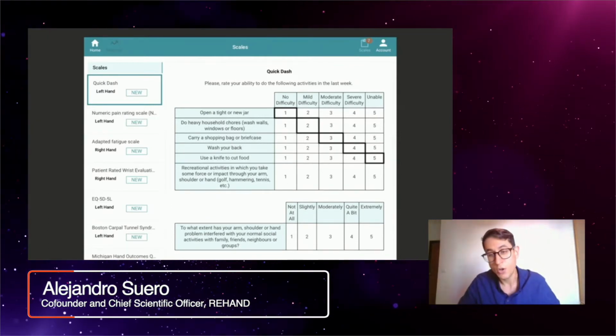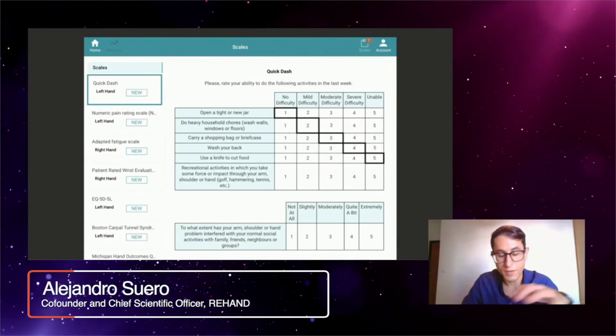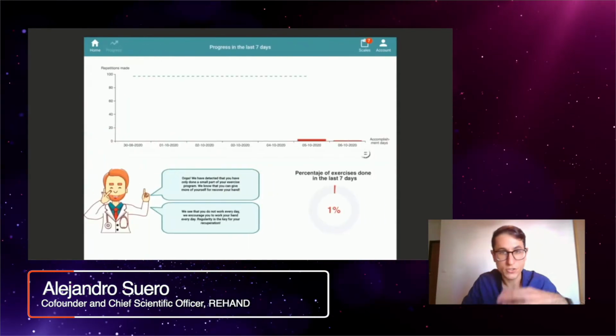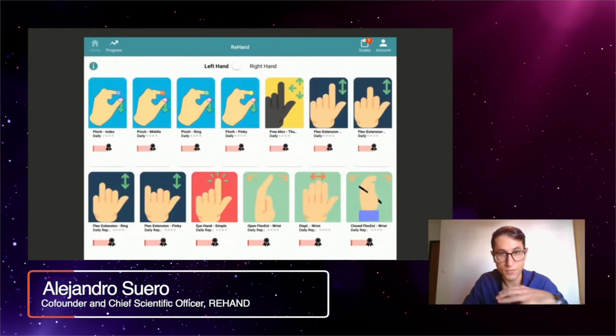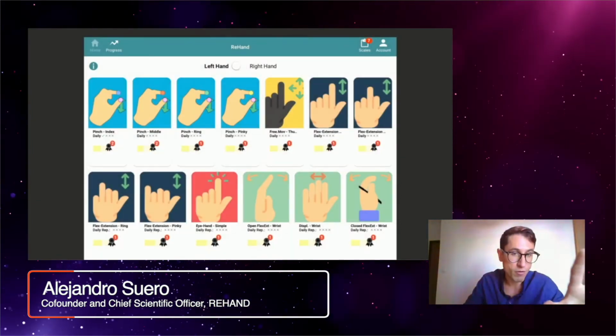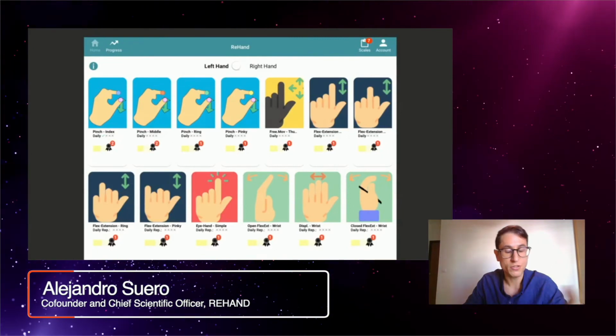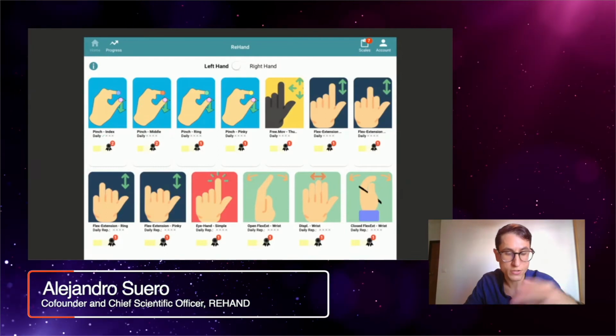So basically, we receive an email every week with all the info in order to know if the patient is doing or not the exercise, if the patient is doing the exercise right or wrong, and with the results of the scale. So with this info, I can decide to keep my patient working at home, or I can tell my patient to come back to the hospital because there is some sign of complication that we need to see.